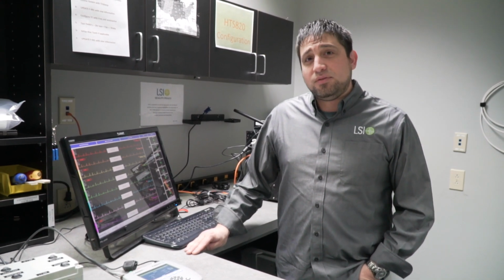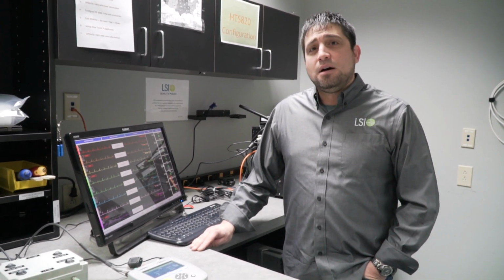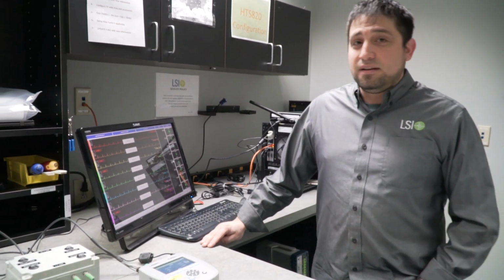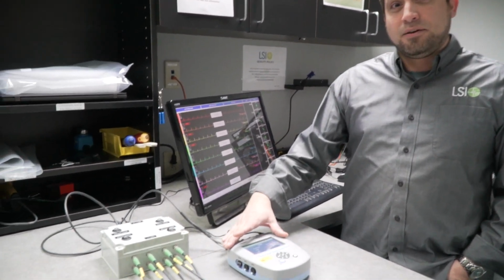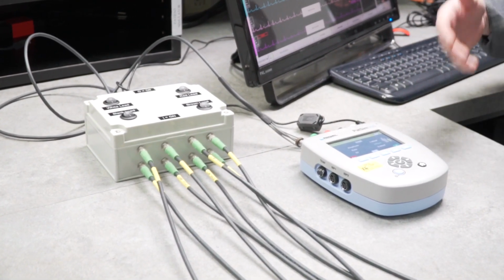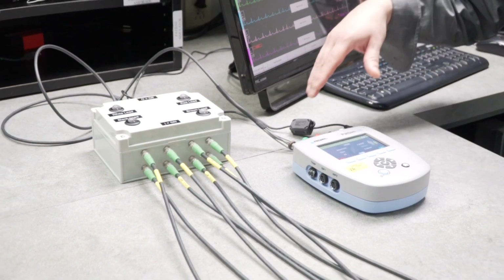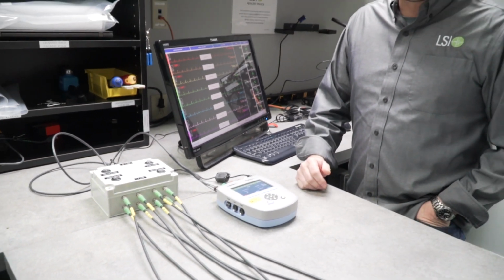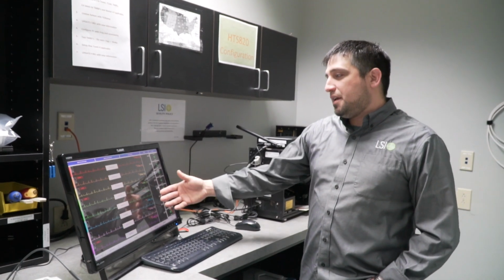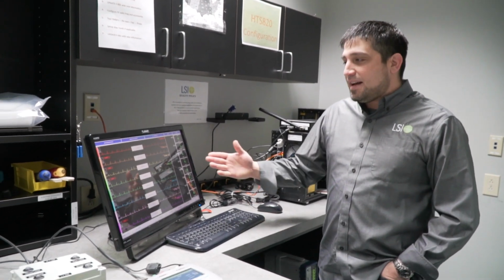I did my project Capstone on a heart simulator splitter. Basic concept is to have the patient simulator, which simulates a human heart rhythm, and it outputs that to one of our transmitters, and that transmitter will broadcast that information or data back to our receiver and then be displayed here on the screen as a patient.